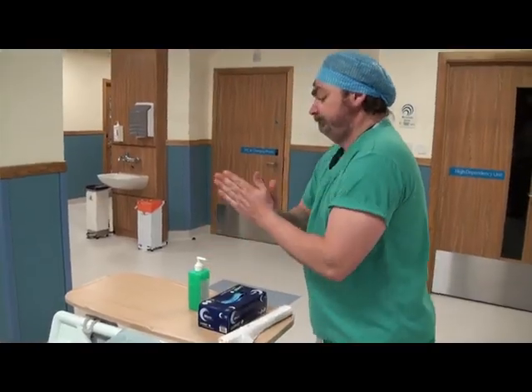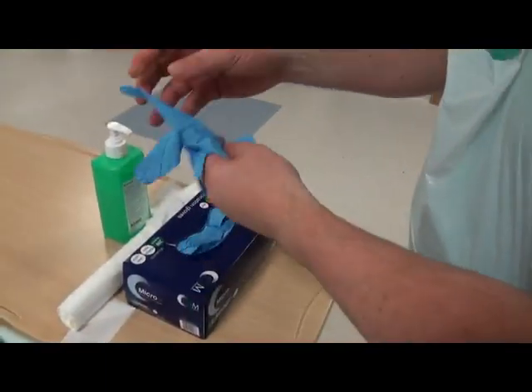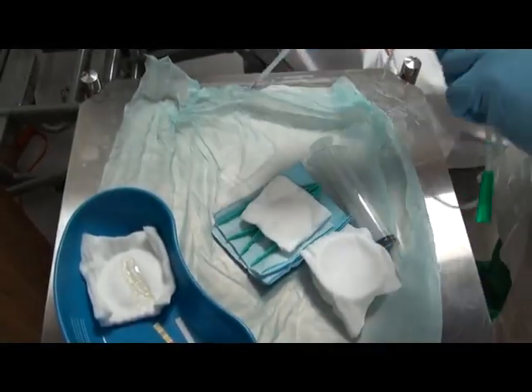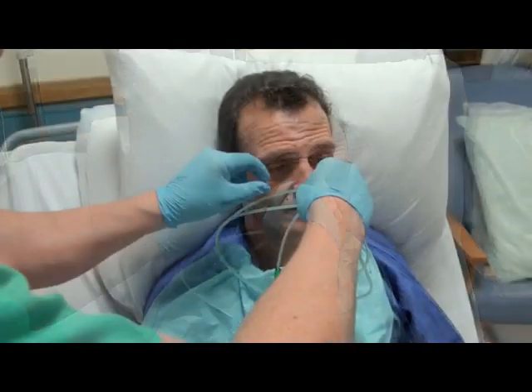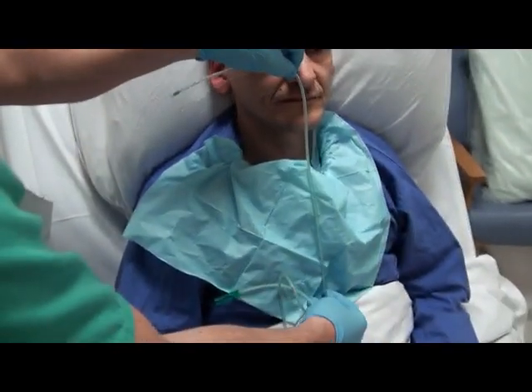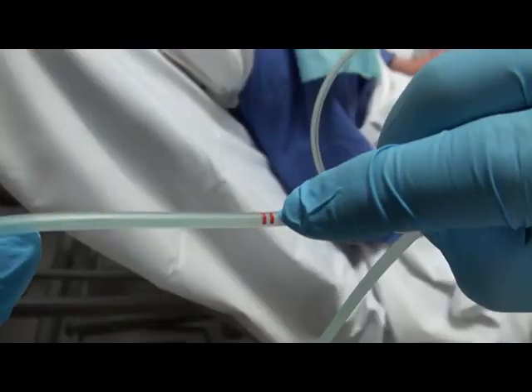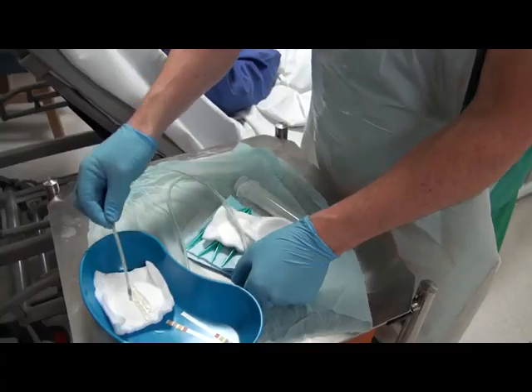Prior to insertion, the practitioner should decontaminate hands and don a disposable apron and nitrile gloves. Measure the size of the tube from the ear lobe to the nostril to the xiphoid process. This will give you a rough idea of the required length; ensure you note the appropriate marker on the tube.